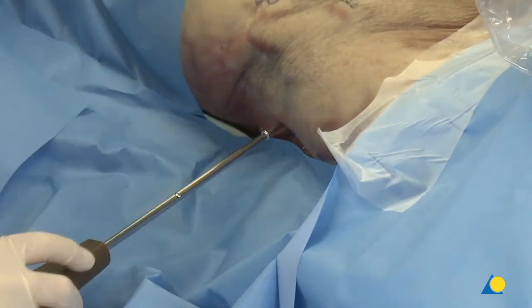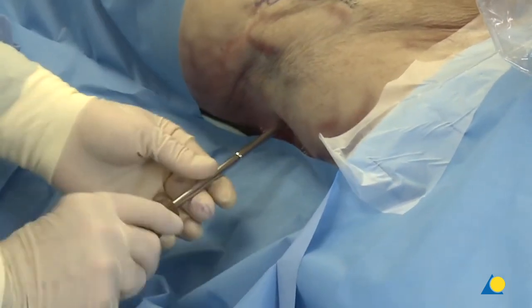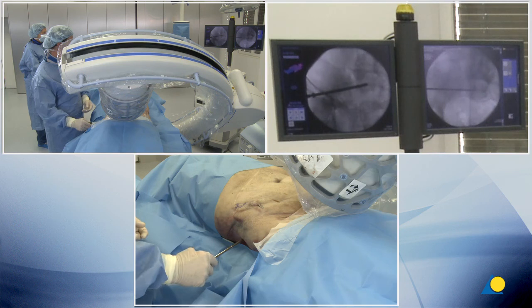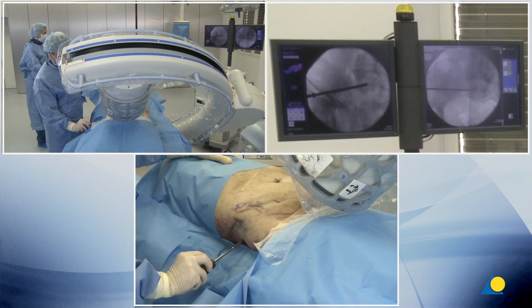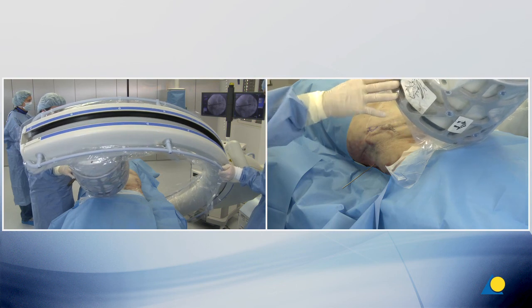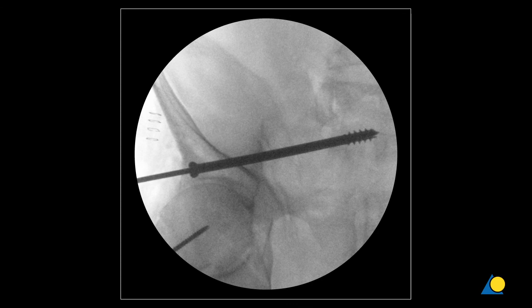It is important to carefully tighten the screw to avoid intrusion of the screw head into the ilium and loss of purchase. Using a washer can avoid this. If an obturator outlet view is obtained, the posterior iliac cortex is seen, so when the screw head contacts the cortex, insertion is stopped.